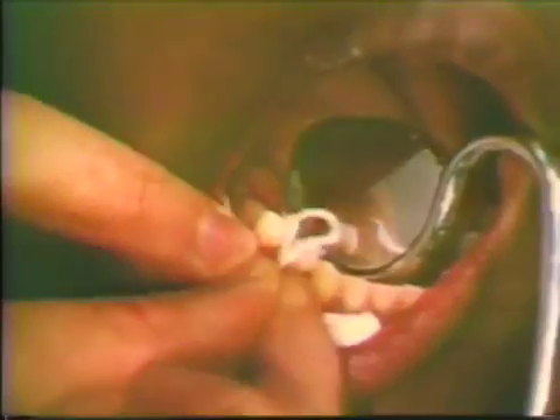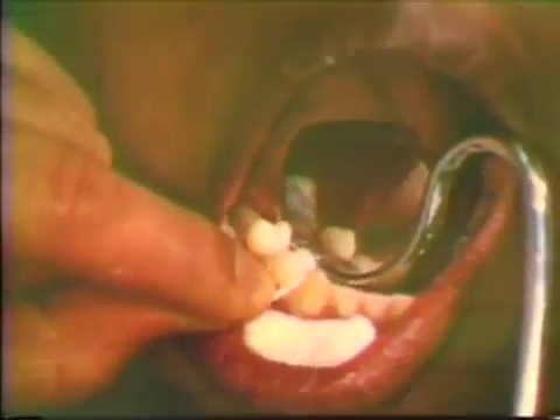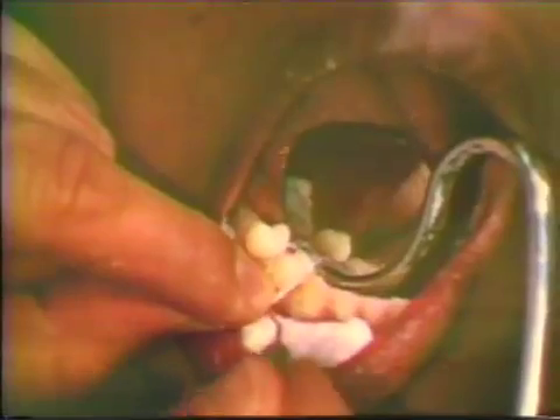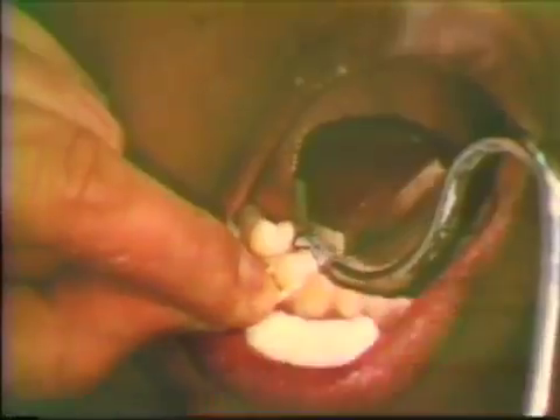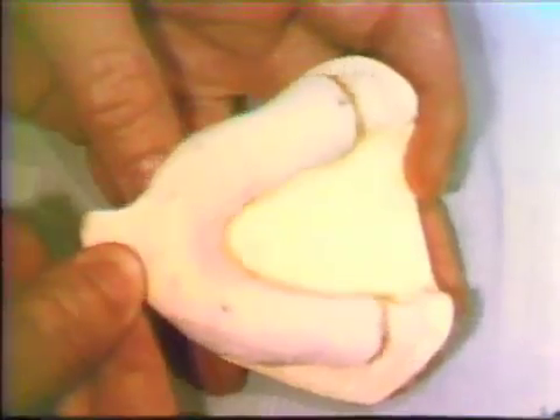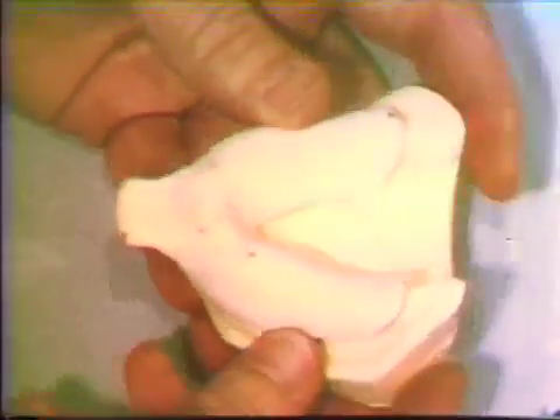Prior to recording the impression for fabrication of the gold crowns, gingival retraction is necessary. Commercially supplied gingival retraction material such as Gingipack is suitable for this procedure. Utilizing the study cast, a custom resin tray is manufactured for recording the impression of the individual tooth preparations.